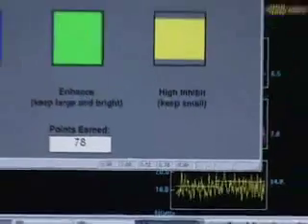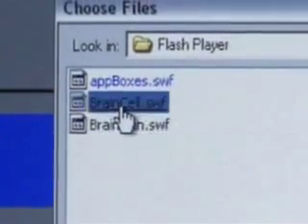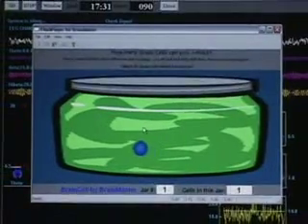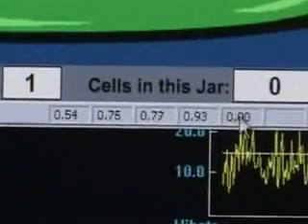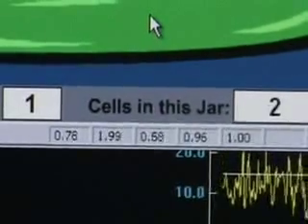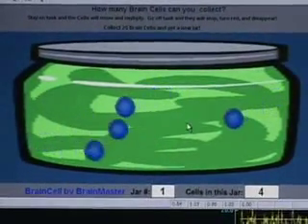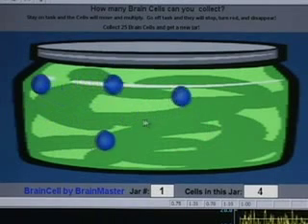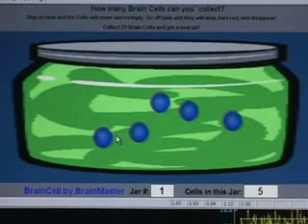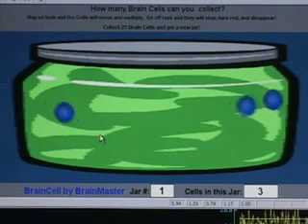Let's back out and pick a different flash game. If you go to the file menu on the upper left and choose File Open, these are the available flash games — one of them is Brain Cell. If we choose Brain Cell, the Brain Cell game starts. The way the Brain Cell game works is it watches variable five to see if the condition is being met, and if it is, brain cells appear in the jar and begin to move around. The balls start and stop as training conditions are met. If training conditions are met for a certain period of time, more balls are created, and if conditions are not met, one of them will turn red and vanish.